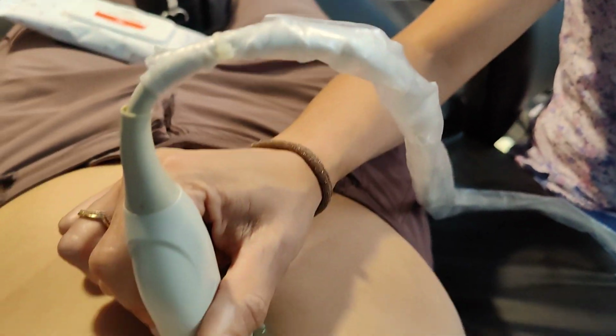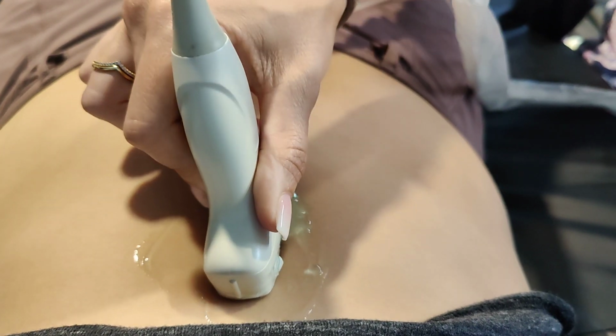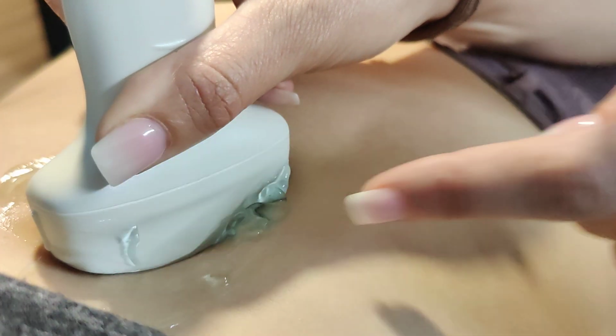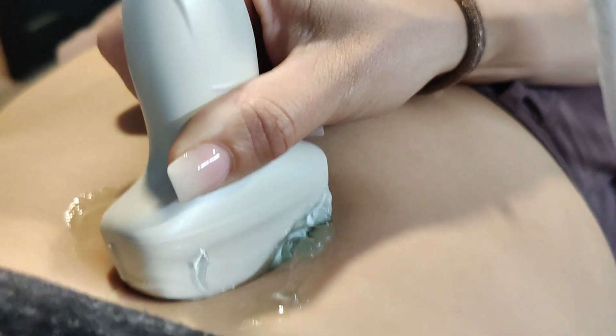When I'm scanning the tail in the long position, again, I'm slightly oblique. I'm not completely straight on the patient's body. So for the tail, I take the end of the probe and rotate it slightly this way. So your probe's almost at like a 1 o'clock on the clock. And we see the pancreatic tail.